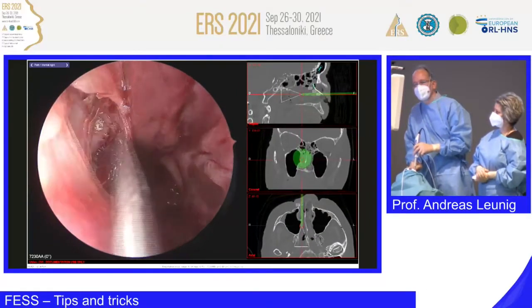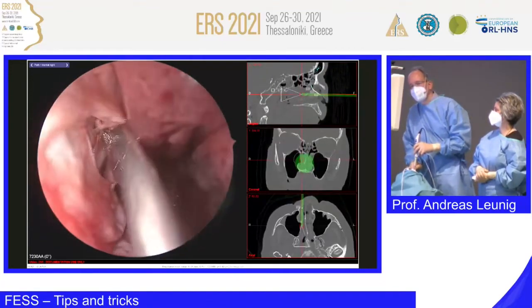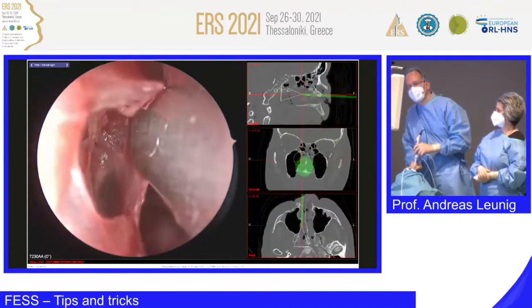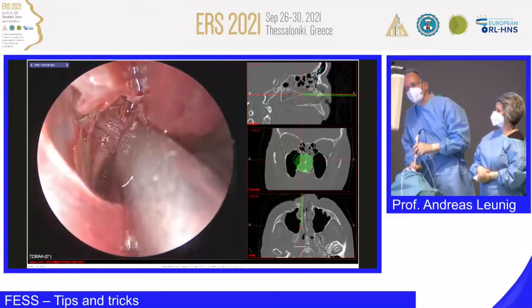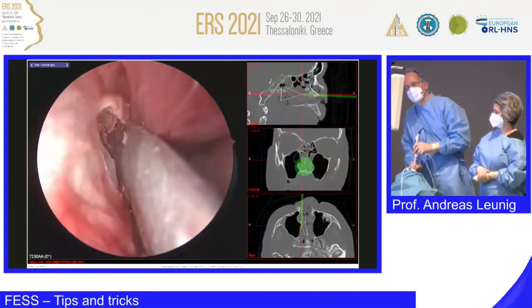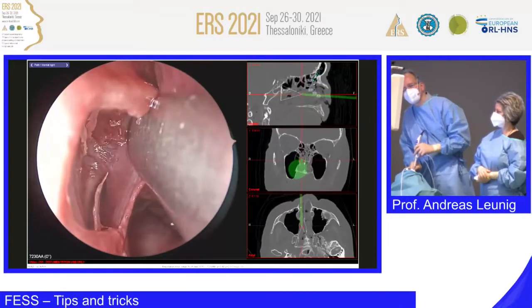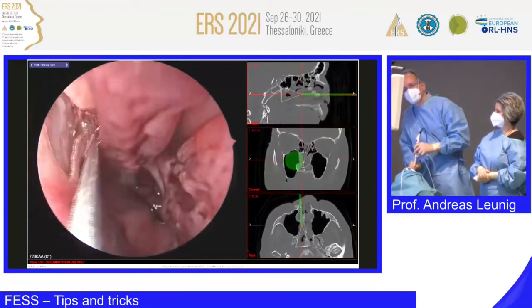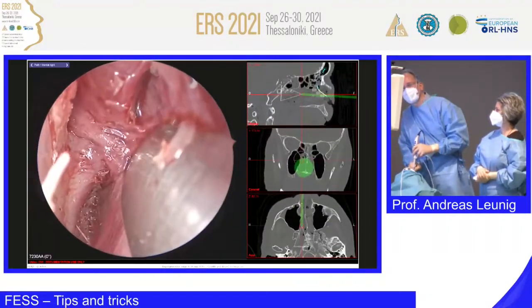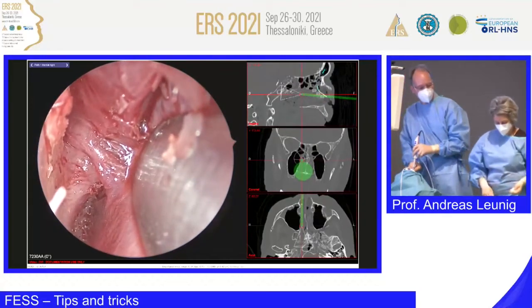And now, don't do it too much, otherwise, it's up here. That must be a crista ethmoidalis, and that's where the artery is coming out. I have to elevate this a little bit more. So I think you can see it here, that's the artery coming. Oops, it's narrow. So here, can you see it now? That's the foramen.